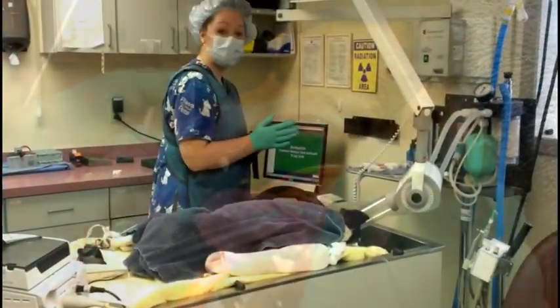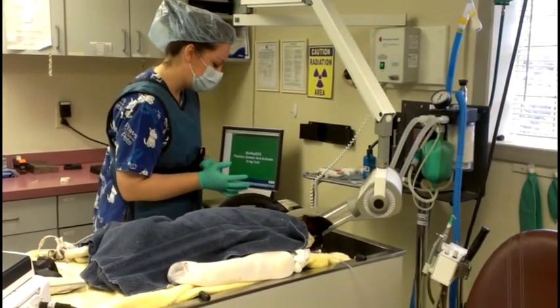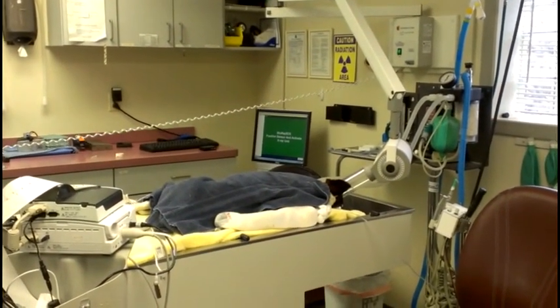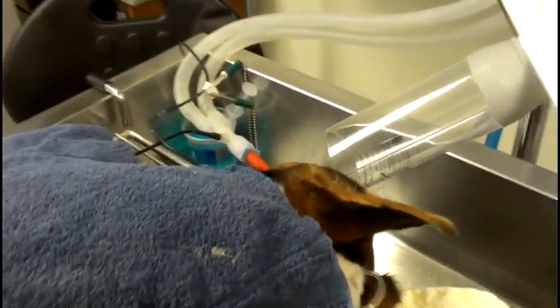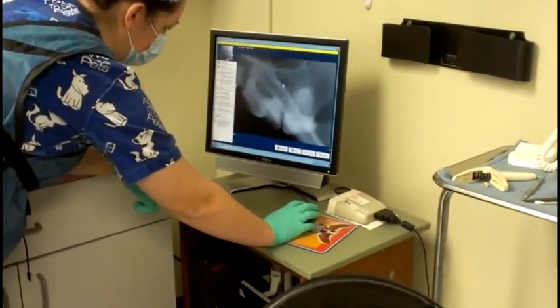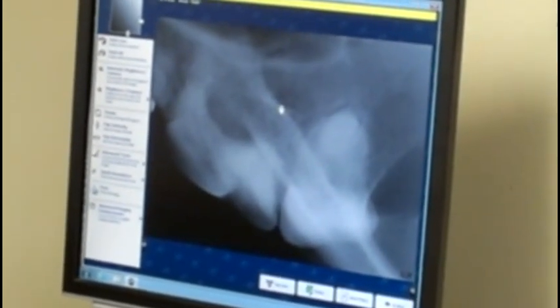Go ahead and take some digital dental x-rays of that upper tooth that I showed you. The plate just goes in the mouth, just like when you get your x-rays done. Here we have a little x-ray unit. I'm going to go ahead and take that and see what it looks like. Since it's digital, it allows us to play with the brightness and contrast a little bit so we can get a better view of that tooth. And in just a little bit, when Dr. Shardy comes back and does her oral exam on Mabel, she'll evaluate that x-ray, and we'll see if there's any further treatment that needs done for that tooth.